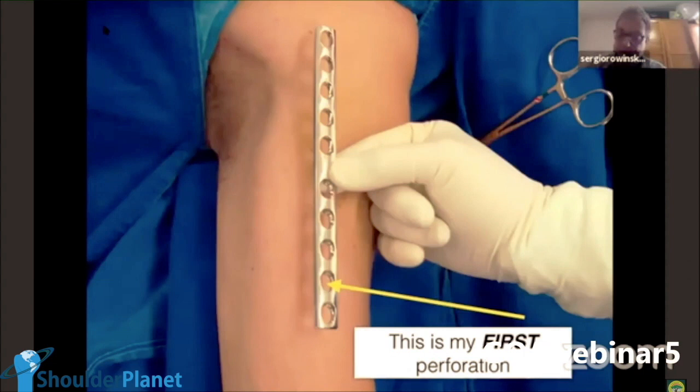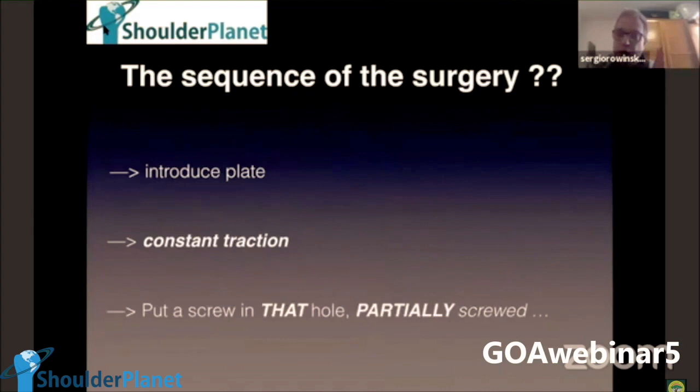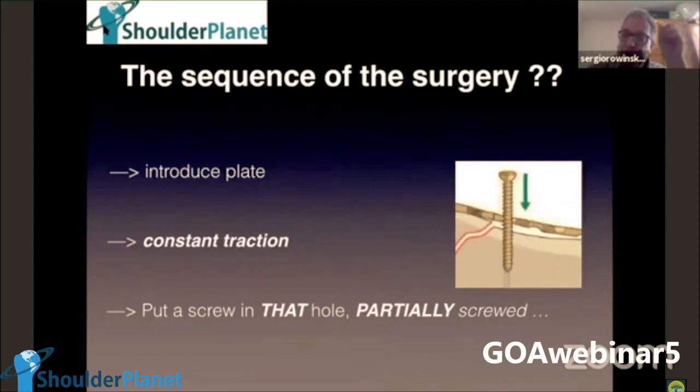It doesn't matter. And after that, I introduce the plate. The traction is there all of the time, with semi-flexion. There is one guy that is always doing this. He's there only for traction. And I put a screw in that hole, partially screwed. This is a very key point.